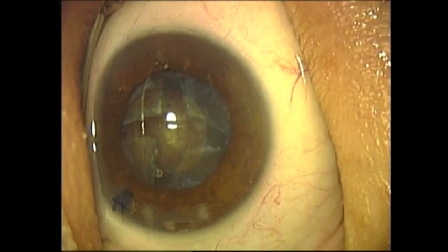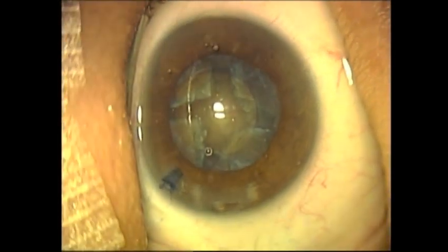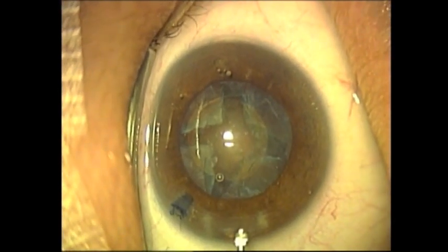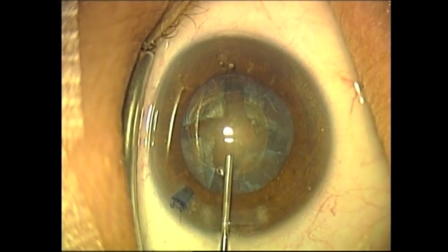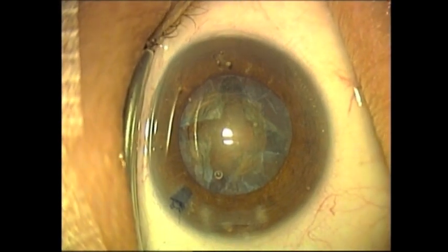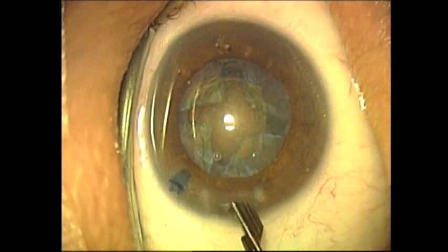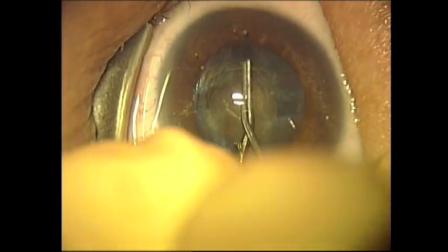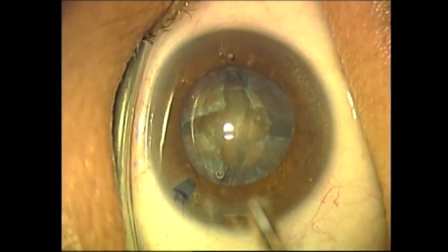viscoelastic — specifically Alcon Viscoat — is injected through the 3-millimeter corneal wound in order to protect the corneal endothelium, maintain the anterior chamber, and also facilitate what we are now seeing: the cracking of the lens nucleus into four quadrants.